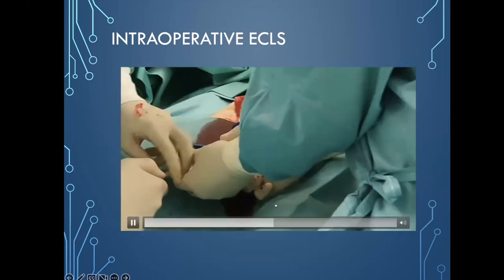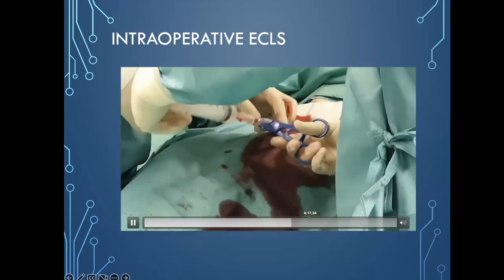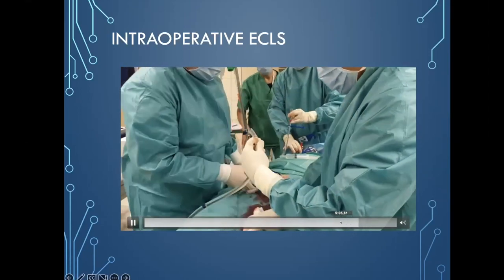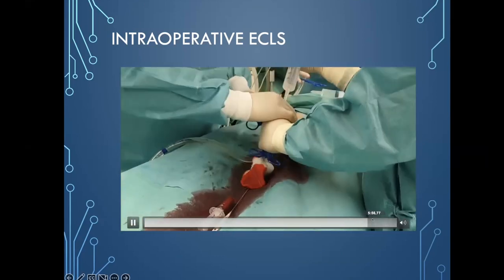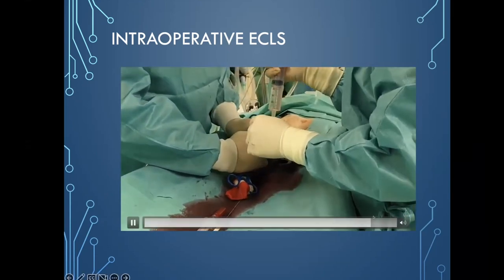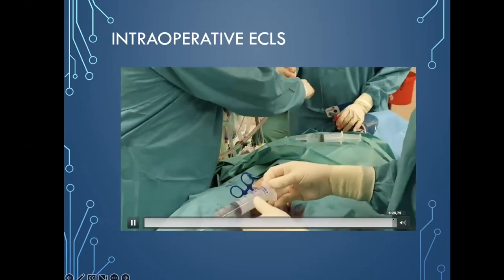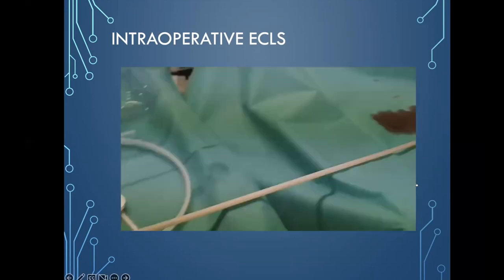And as you can see, the wire is removed and it is really venous blood. So then we flush with some water, and afterwards, simultaneously, the jugular vein is also cannulated, and then you connect your cannula bubble-free, just as we know from cardiac surgery, and afterwards you start your ECMO circuit, and if you really paid attention to all these pitfalls, it's not going to be a problem at all.